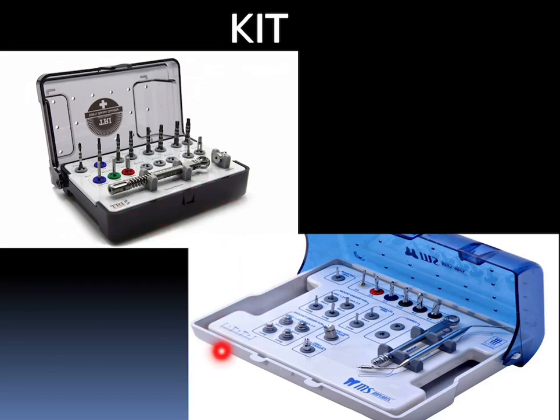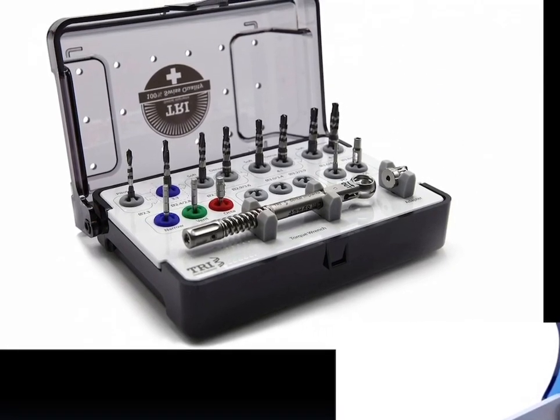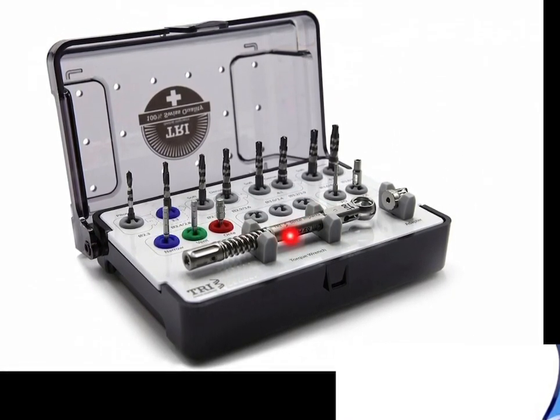Now when we talk about the implant kit, it can be a simple, that is a beginner's implant kit, or it can be an advanced implant kit which is shown over here. Now when we talk about this part of a dental implant kit, this is the ratchet driver what we see and these are the drills. These two things are the parallel pins which are used to see the parallelism of implants when we are placing multiple implants. The first drill we use during the implant placement is called the pilot drill, which is about 2 mm, which is shown over here.